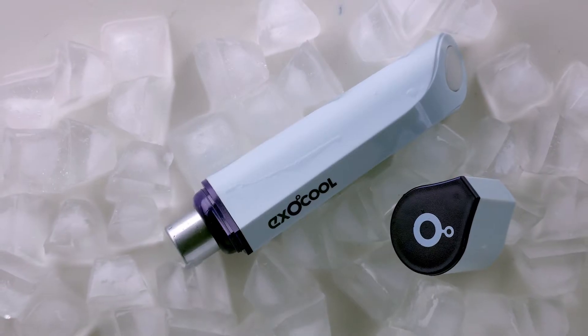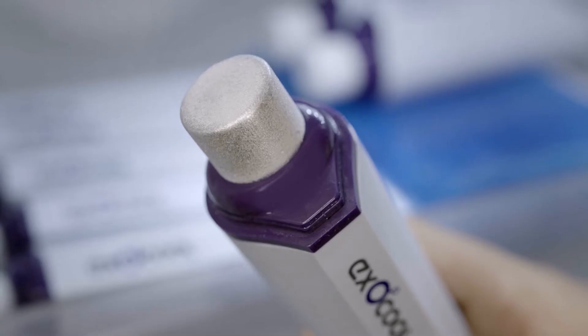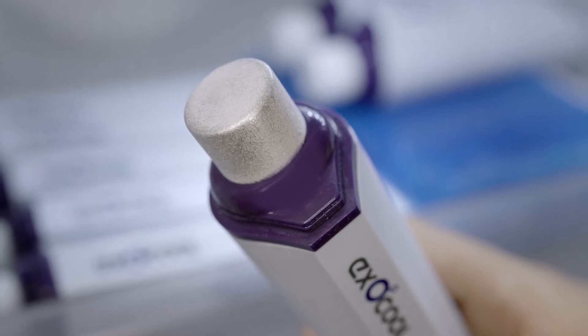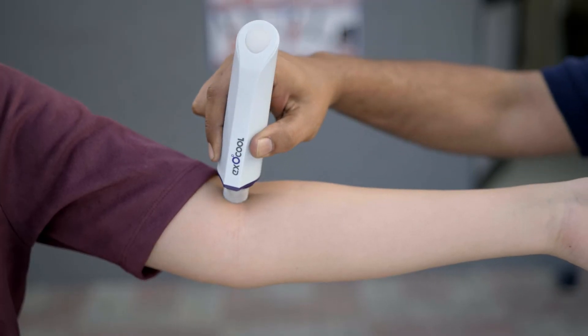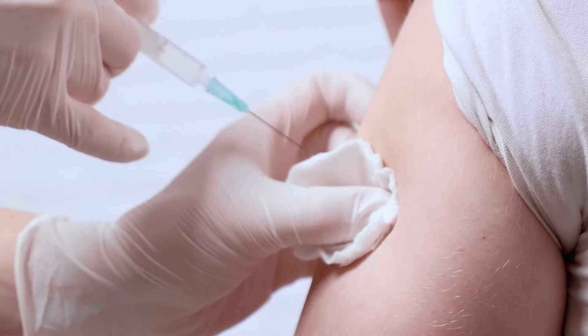The metal tip made of medical-grade aluminum alloy makes ExoCool safe to use on all skin types. It can be used easily by anyone. Freeze it. Apply it to the skin. Inject the syringe without any pain.